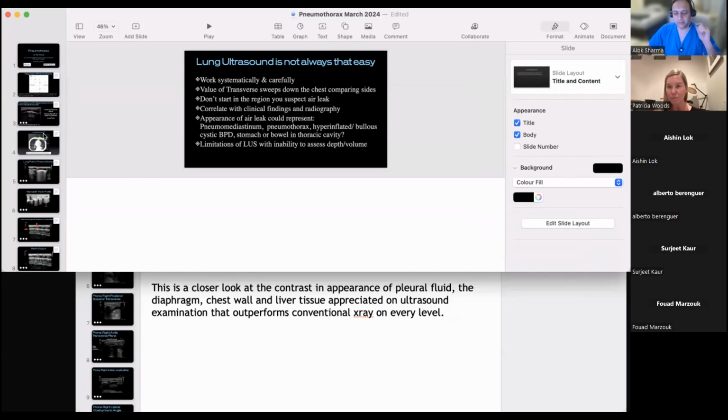Yep. So can you hear me, Trish? Yeah, great, fantastic. So we've got a question from Ahmed Moharram. Ahmed, are you able to unmute yourself? Probably not, so I'll ask the question on his behalf. Okay, go for it, Ahmed. Hi. Thank you so much for this brilliant talk. Very informative and comprehensive. Just one question. Can we use lung ultrasound to decide either to go conservatively managing the pneumothorax, or that we need to drain this pneumothorax? Or shall we go clinically?